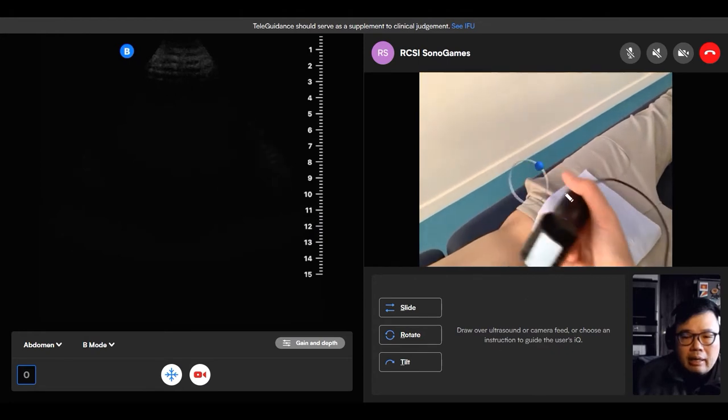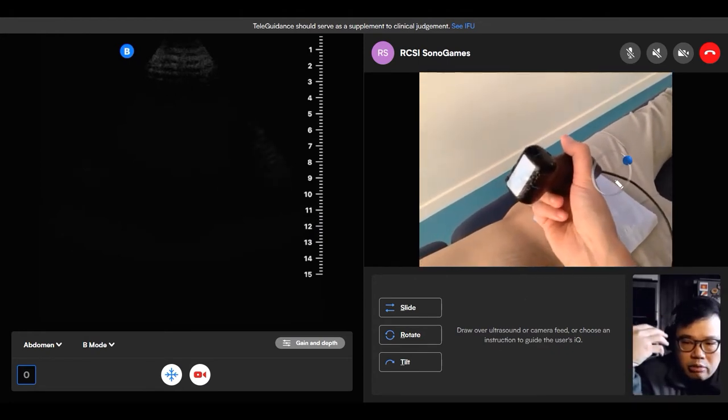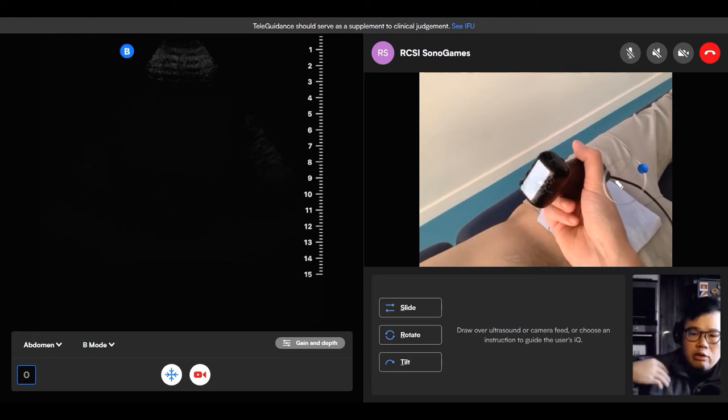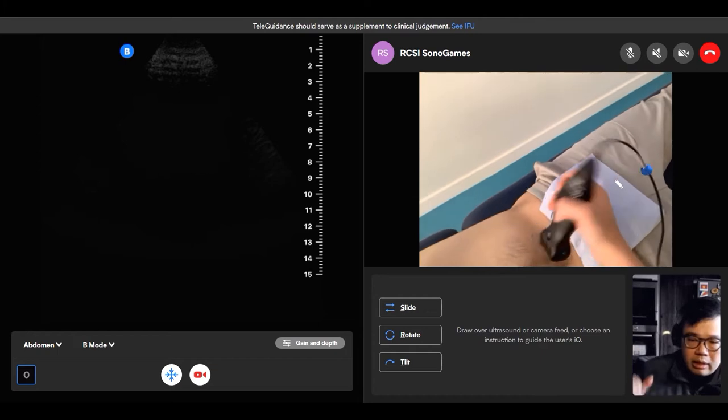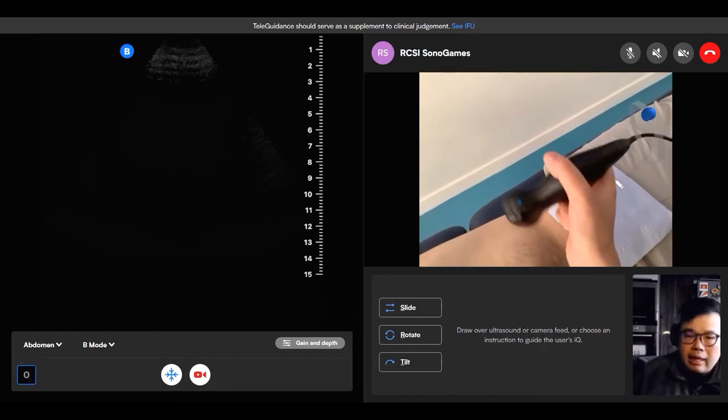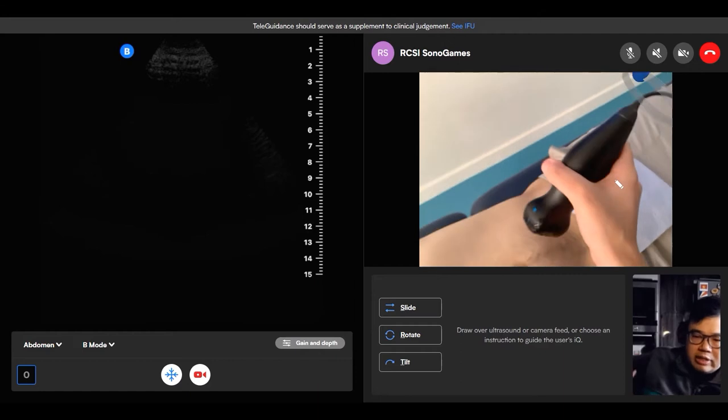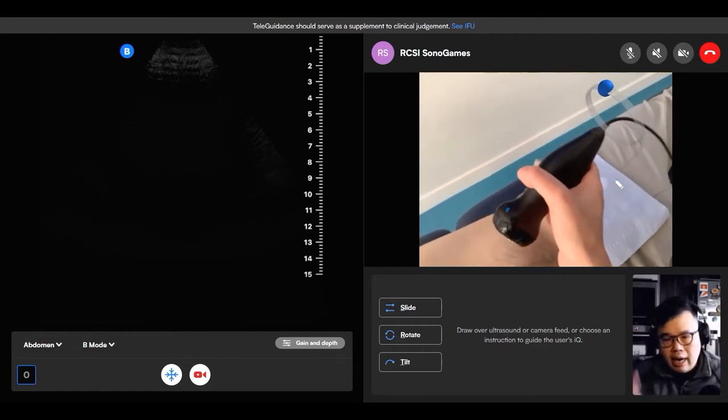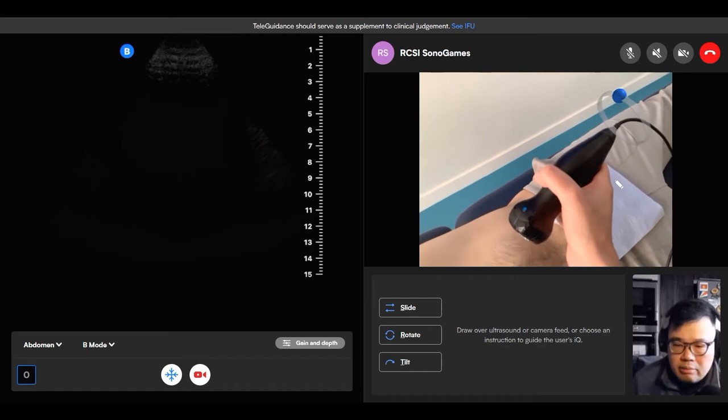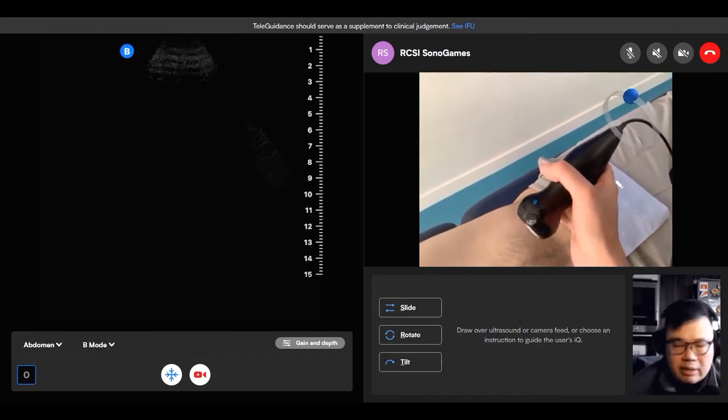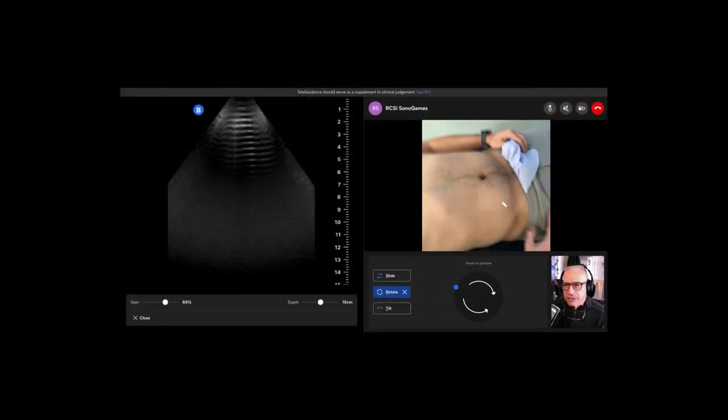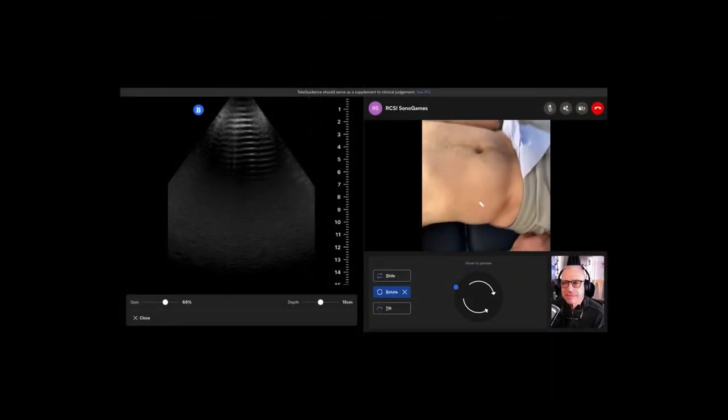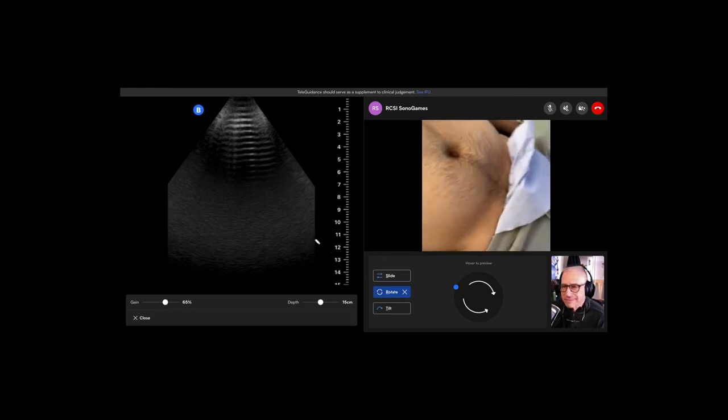And, you know, for the Sono Games, I suspect that you should demonstrate that you're actually clearing it. And you can say that you're clearing it by actually tilting the probe. So fanning through, clearing the pelvic. Yeah, exactly. So whichever space that you're clearing, you just, you know, you say that I'm tilting. Note that it's cleared? Yeah. To make sure that there's no free fluid in all areas of that particular zone. Perfect. Bladder. Bladder scan.